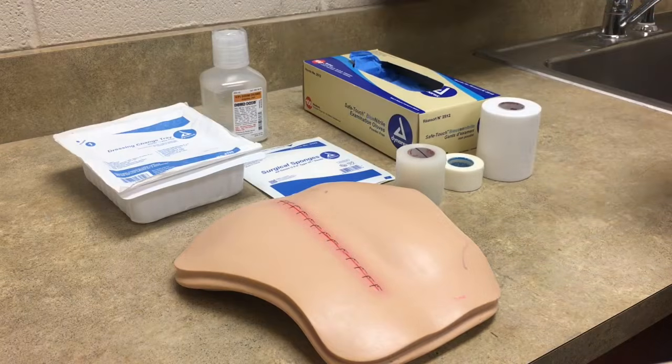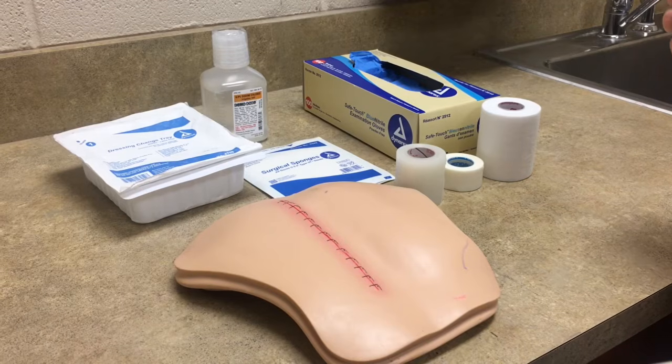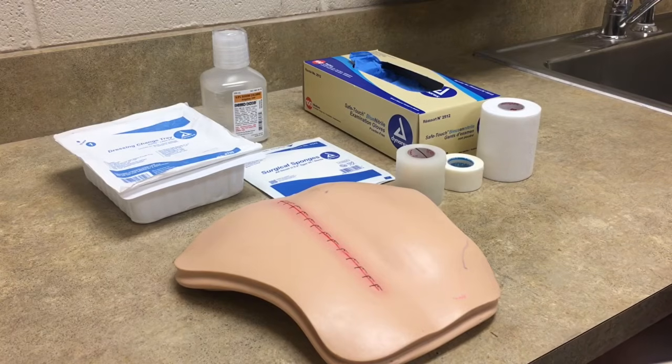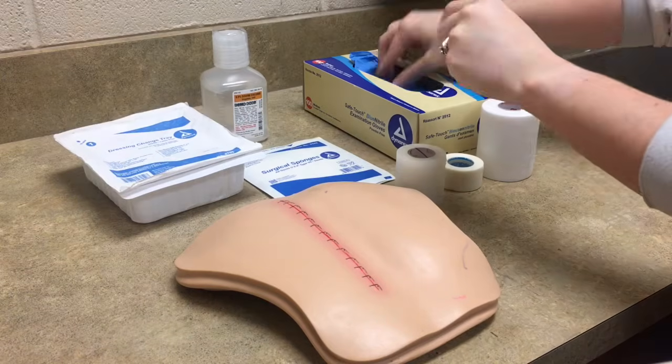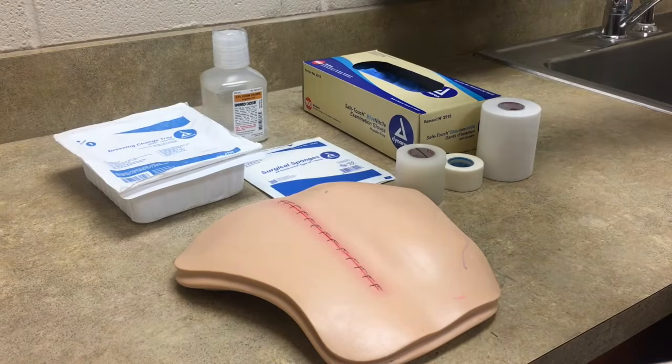We're going to dispose of the soiled dressing and gloves appropriately. You never want to put blood in the trash, so obviously that would have to go in a red bag, and you would have to dispose of it appropriately depending on whatever would be per your institution. So we are going to again perform hand hygiene and apply gloves. Since this is a clean dressing, again we're going to apply exam gloves.